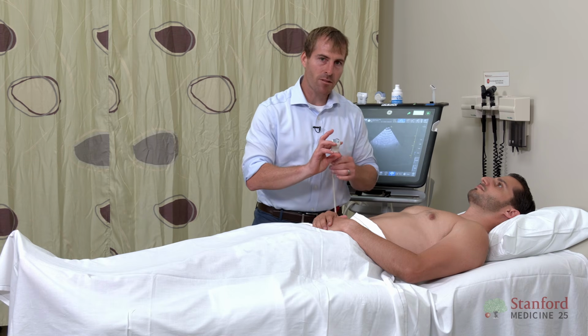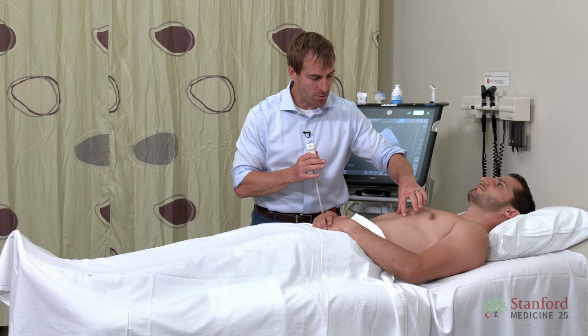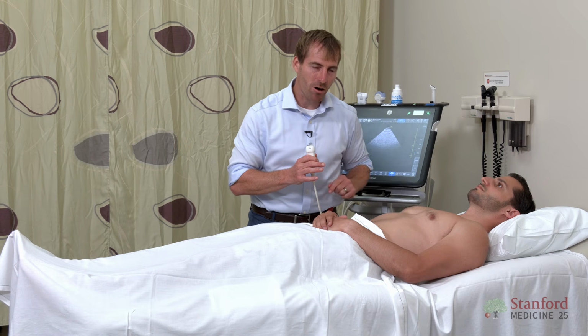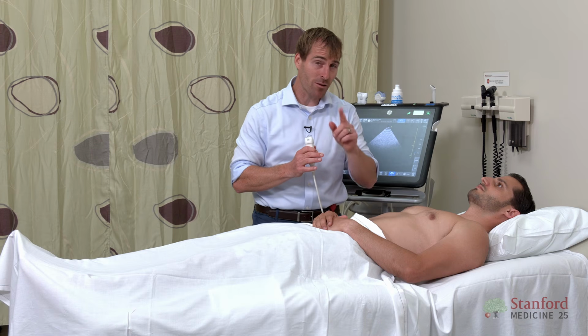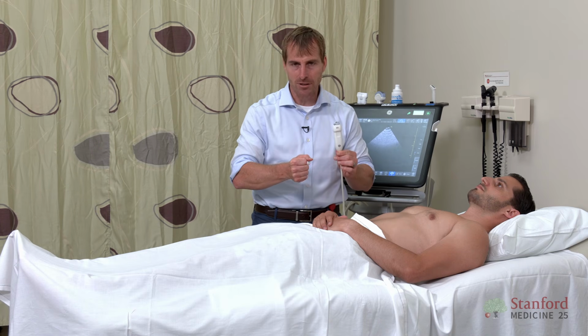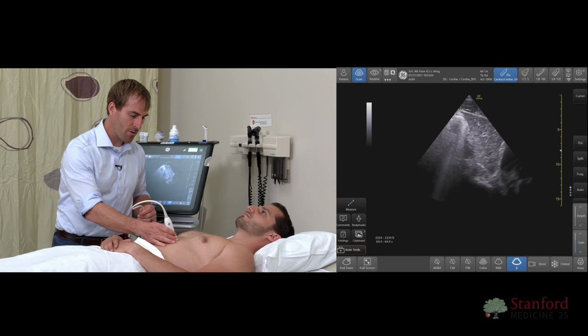I need to locate the patient's xiphoid process. Now, when you're going to do this, it's where the ribs meet. There's a little spot right there in the center. Don't push hard on it. It's uncomfortable. And so you want to know where it is because you don't want to place your probe right on top of the xiphoid and then start mashing down. It's going to hurt your patient. So let's go ahead and place the probe here, all right?